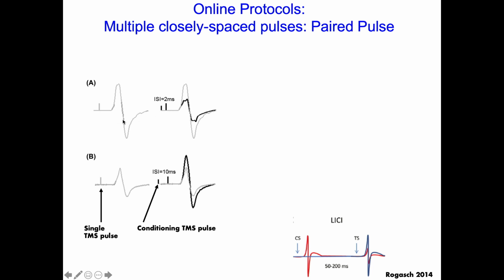So this is the response I see with just a single pulse, and we've traced that again here. If I do a little conditioning pulse ahead of time, okay, I've actually inhibited or quite dramatically decreased the response. If I extend that time, say to 10 milliseconds, I can actually create a facilitation, an increase, against the baseline. All right, so here's a baseline response, and here's the increase that I see. Okay, so the ISI, or the interstimulus interval that I choose to use, can play with what's going on there. What we think we're playing with is a response of different neural systems in a very local location. Some that respond to GABA, some that respond to glutamate, so inhibitory and excitatory neurons, and you're playing with their dynamics with each other. Okay, and so you're able to actually look at separate GABA systems and glutamate systems inside one particular area, in this case motor cortex, by using what we're calling paired pulse stimulation.